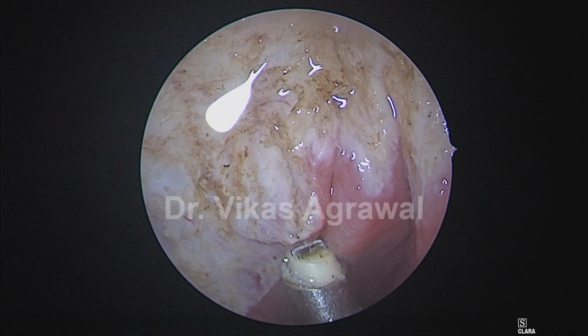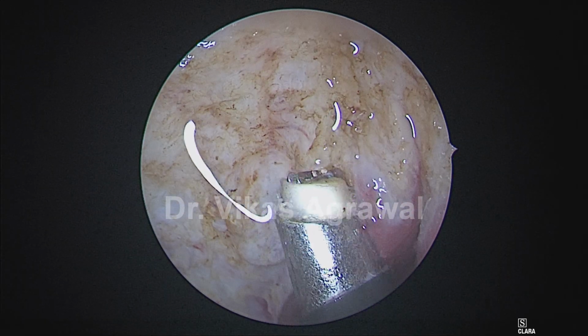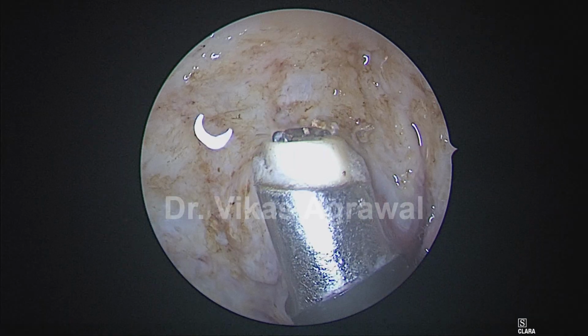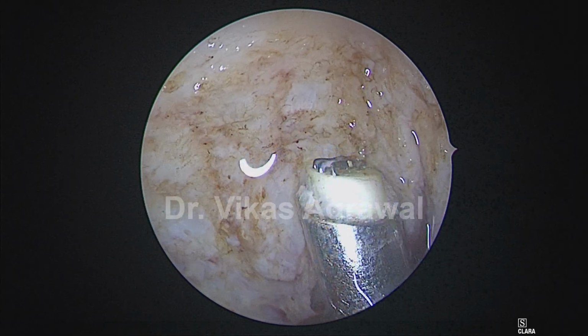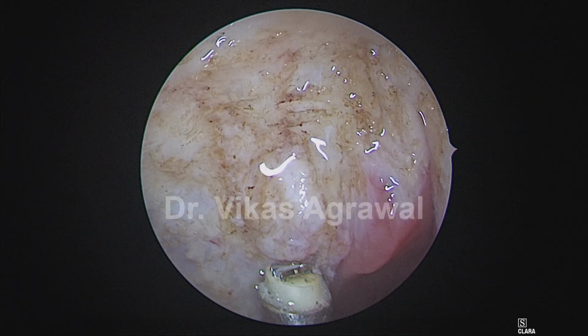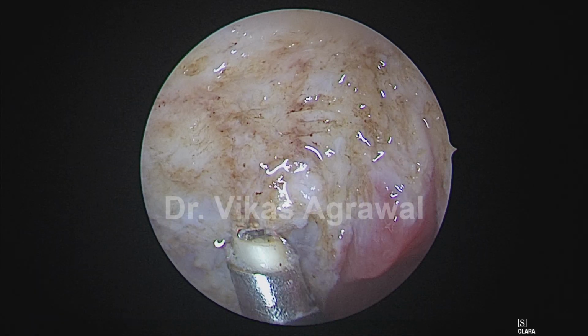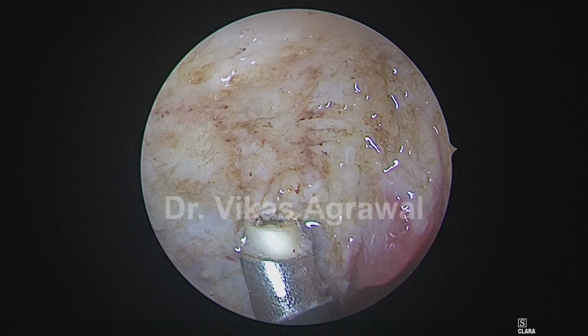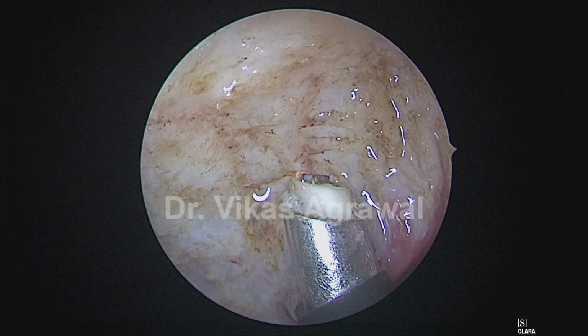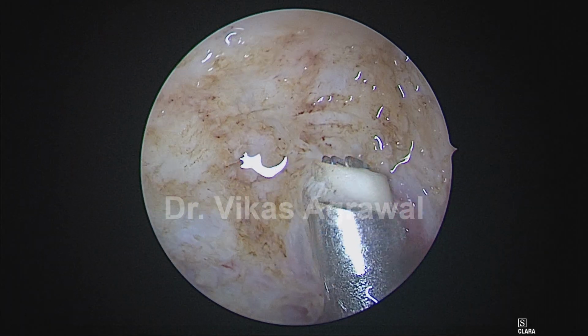Obviously, there is none in this case. So that's the buccopharyngeal fascia, right? Will not open up the fascia, will only define the fascia. All right.